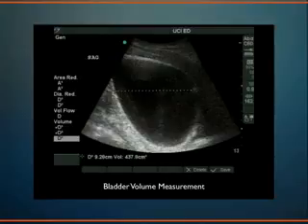Well, some of them just urinated in their diaper, and you would unnecessarily put them through the procedure of a bladder catheterization, which is painful. So you could avoid that unnecessarily, you have to wait until the bladder fills up, basically. So I train my nurses to do this, and they take a peek at the bladder before they bother putting a catheter into a small child.